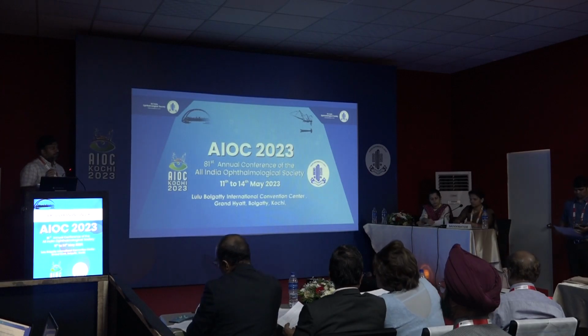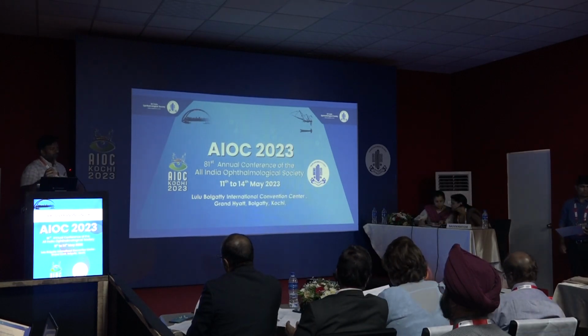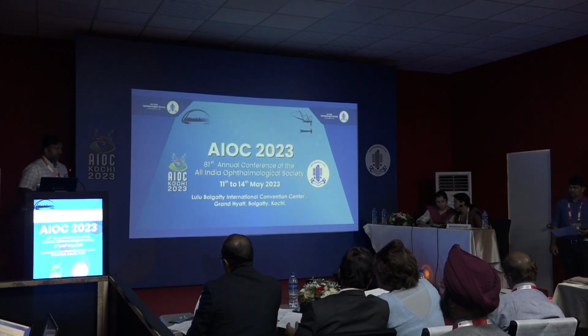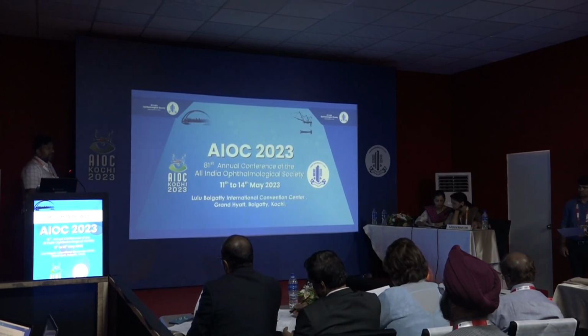The only problem is when the first flange, if you do not center it properly, is a little bit off. If it is a little bit loose, you can again pull the suture and flange it. But if it is a little bit tight, you'll have mild decentration with the SFIOL. That is the only challenge, sir. But there will now be no tilt. Instead, there will be decentration. If it is within the pupillary area, it does not create any problems.